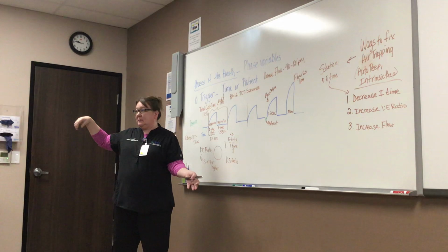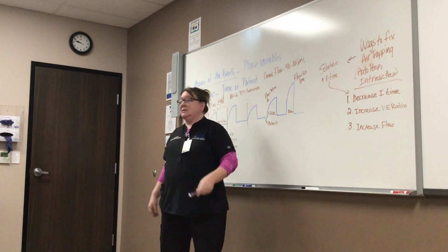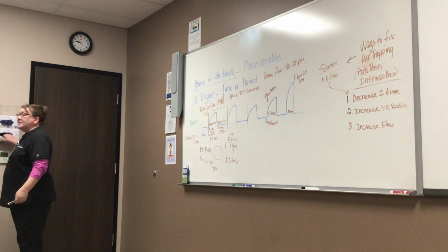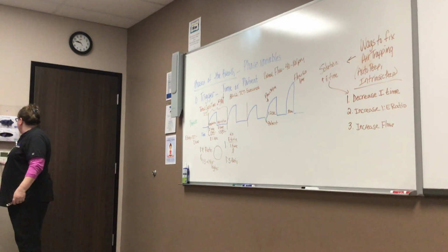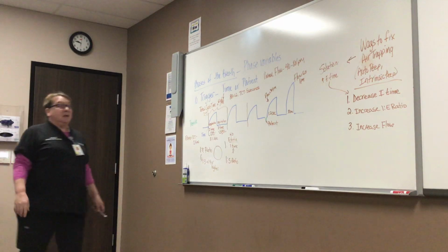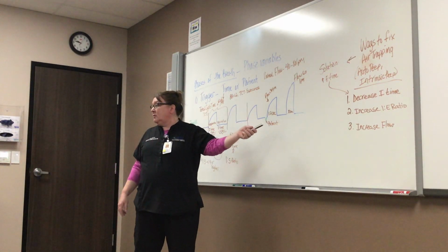Does that make sense? This is a very important concept to understand. Kelsey? You said if you increase the flow, you decrease the what time? The I time. And again, it happens automatically. If you change the flow, you change the I time. If you change the I time, you change the flow.